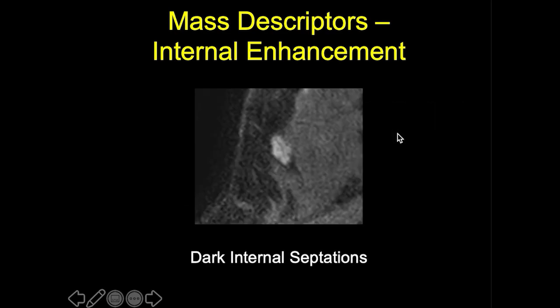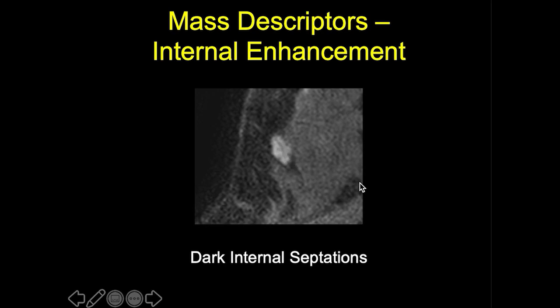There is also a special case of dark internal septations, which is suggestive of fibroadenoma. On the post-contrast sequence, we can see an oval circumscribed mass with a dark internal septation. As an isolated feature, the negative predictive value of dark internal septations is insufficient to exclude malignancy. However, if this is also a T2-bright mass with benign enhancement characteristics, this is likely a fibroadenoma.